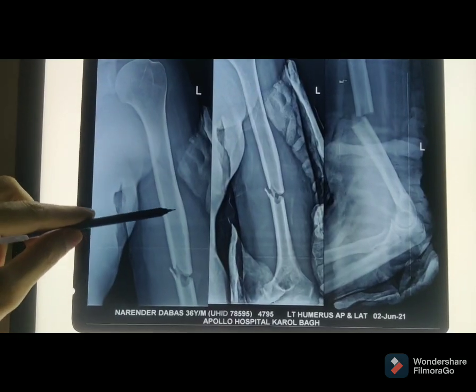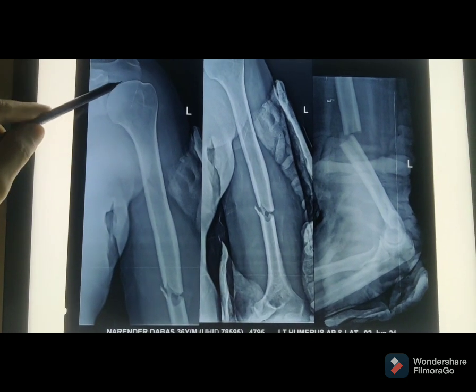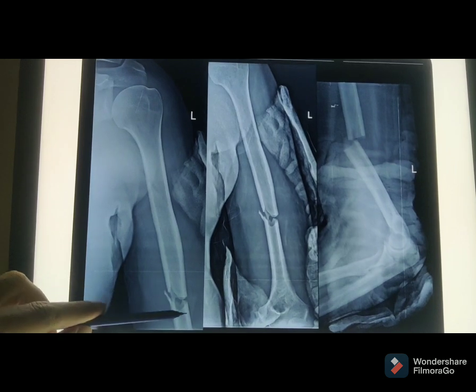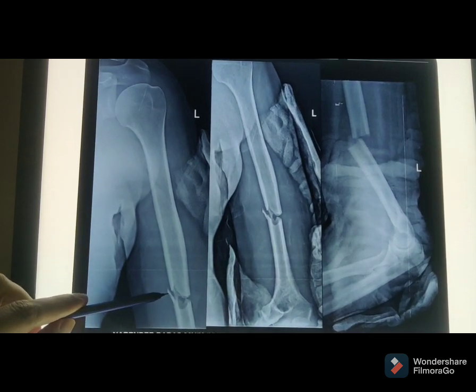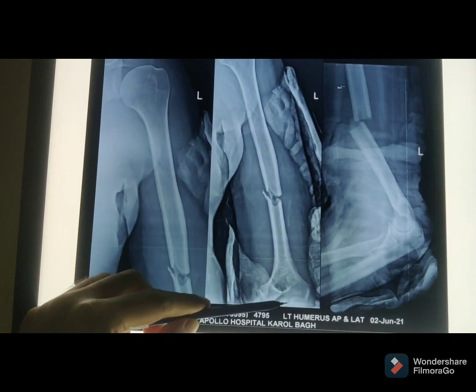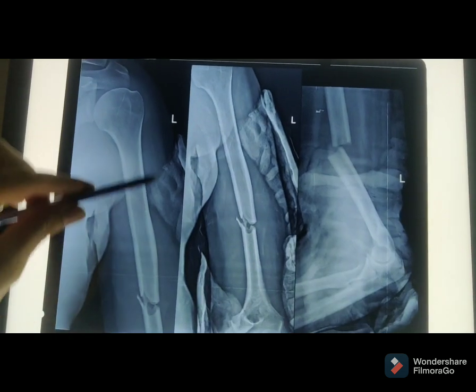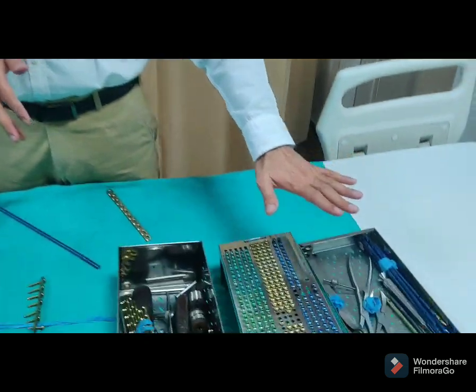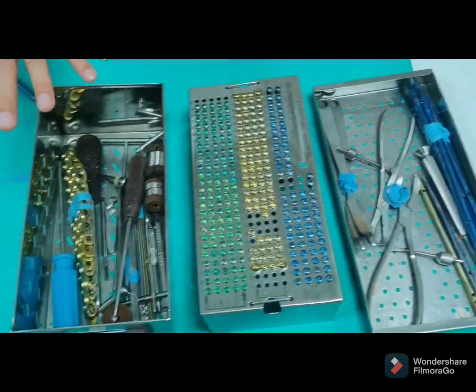We call it humerus. It connects with the shoulder joint. You can see this fracture. This is the whole humerus bone — fracture shaft humerus. These are the instruments and different types of implants that I am showing you.